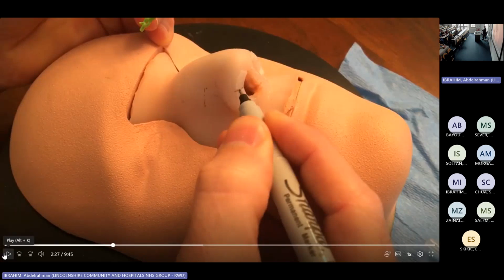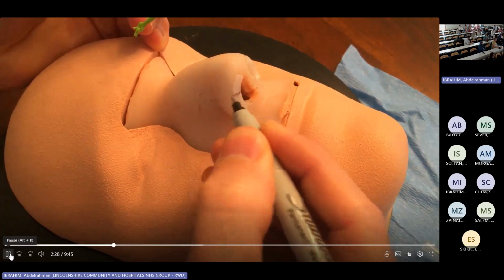So this one, he started with the marking on the lateral side, then the outer side. I found that it's better to mark your lower marks first, because it's midway from the tip to the ala, so it's easier, and then go for the other one on the same level. So this will be the level of the injection. It's just a different way of where you're going to mark, and the same thing. It's just above the lower lateral cartilage and the alar side, which is the soft tissue here. They usually collapse, and it's the junction between the lower lateral and the upper lateral. So this is the edge of the bone, so you can feel the bone, and then he puts these marks in between, supporting that side on the bone, and the other one is just on the alar. And that will guide me towards my pierce point.